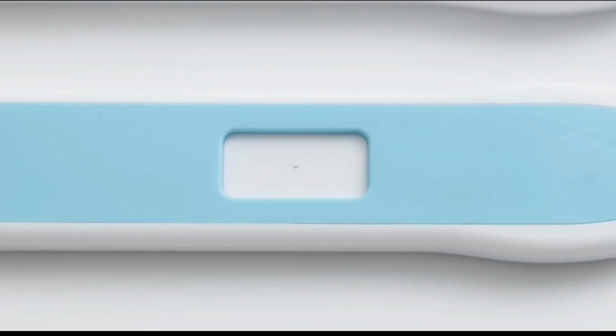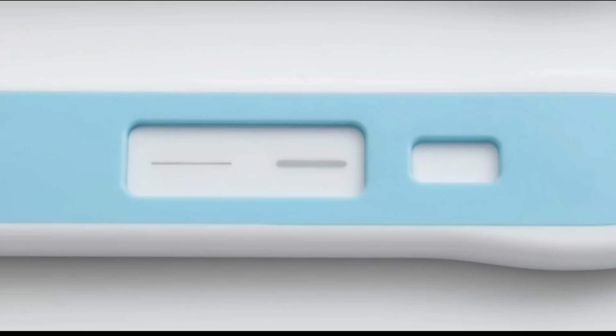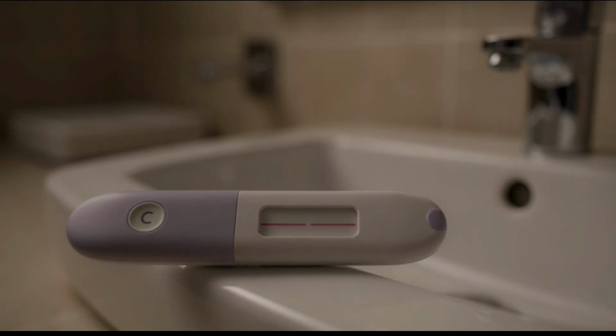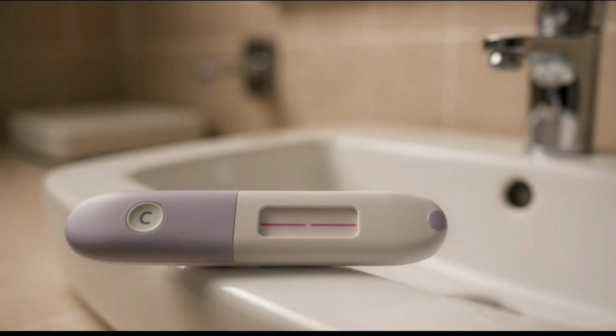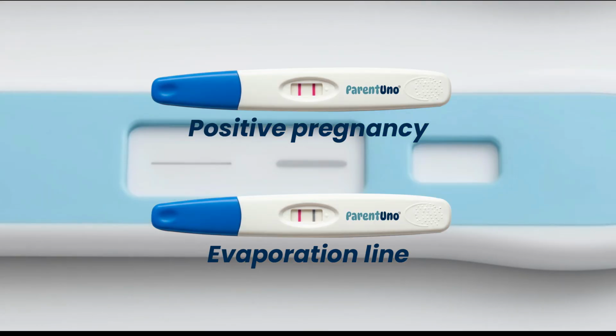Evaporation lines often appear after the reading window, look gray or colorless, and lack the pink or blue dye of a real positive. Before you assume the worst or the best, there's one thing you need to know. Color matters. A faint positive usually has some dye color. An evaporation line usually does not.